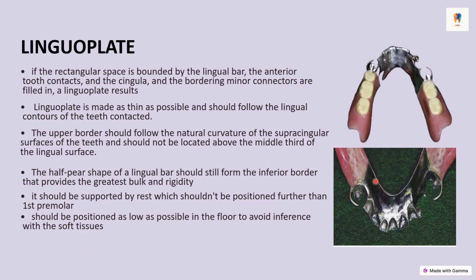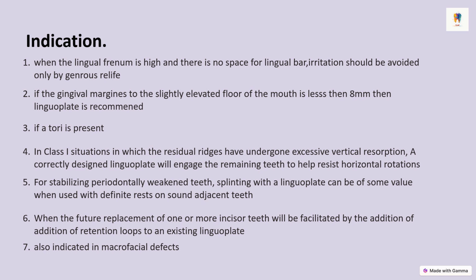Its inferior border should be as inferior as you can place it to avoid interference with the tongue and the soft tissues. So when do we give a lingual plate? We obviously first go for a lingual bar in all the patients that walk in. But what are the indications when we are not going for a lingual bar and we have to give a lingual plate? When the lingual frenum is high and there is no space for a lingual bar, irritation should be avoided only by generous relief.